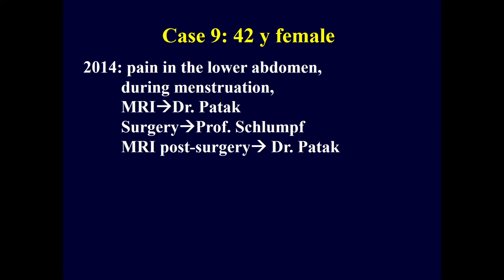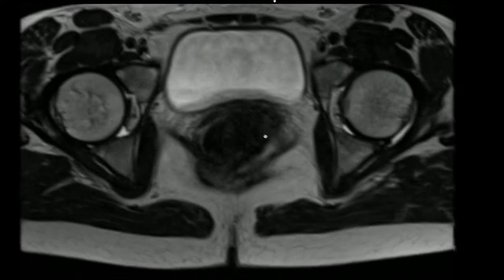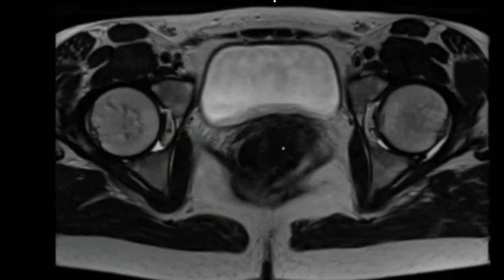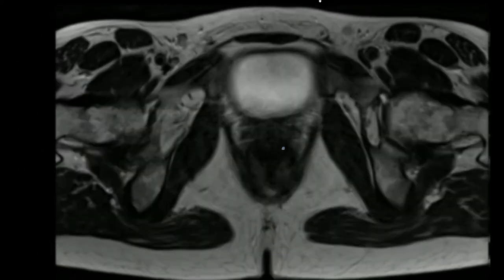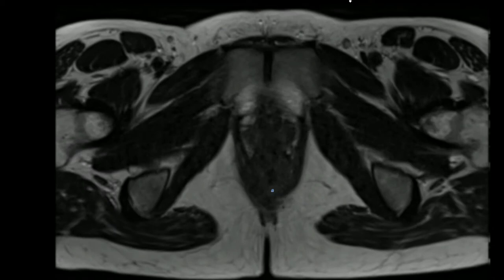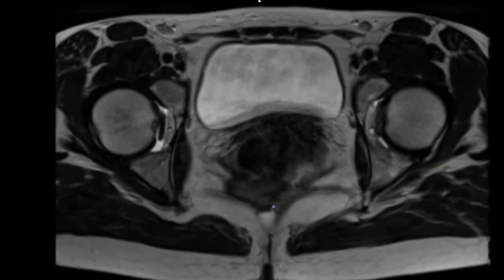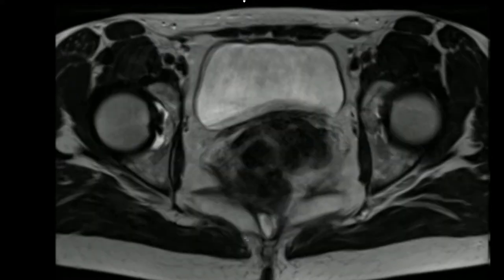The MRI, please. So we did some MRs, or one MR in between, and this is the latest MR that we have. I just show you the transversal images where you can easily see that although the operation was done, there's still some thickening. You see here, this is the loop of the levator ani. This is the anal canal, and still there is some fluid there. Again, this is the top of the coccygeal bone there, a thickening, some fluid.